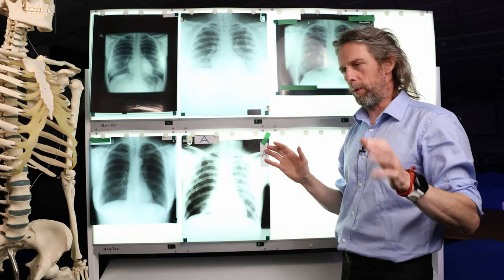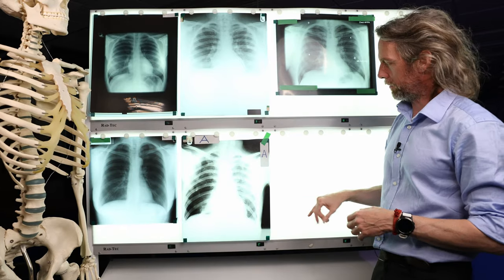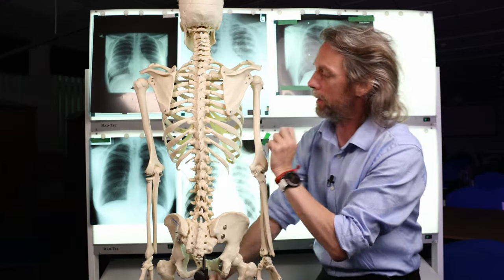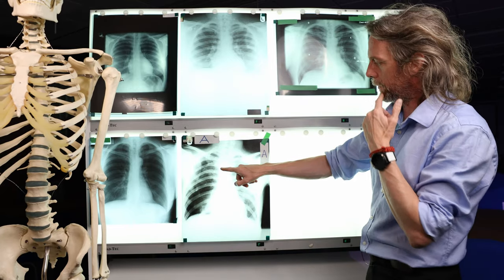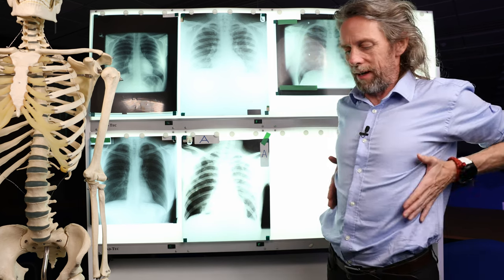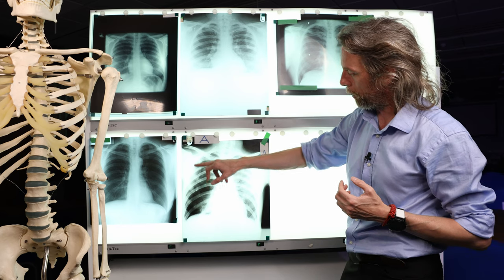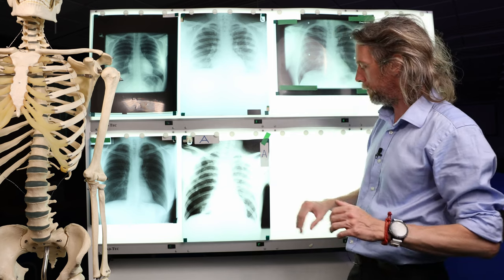Doctors often talk about a posterior rib and an anterior rib, which as an anatomist always unsettles me a little bit, because it's just a rib. They're using shorthand of course to describe the posterior part of the rib and the anterior part of the rib, which disappears on the x-ray as we get to the cartilage. So don't get confused by that. You can see the vertebra, you can see the ribs starting posteriorly. This is the posterior part of the rib and it curves around. After it has curved around laterally, it becomes the anterior part of the rib. It's somewhat easy to get lost as they all overlap laterally, but with practice, keeping your eye in with the curve, you can be nice and accurate.